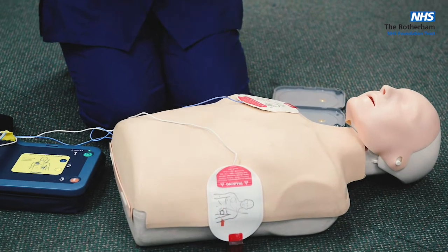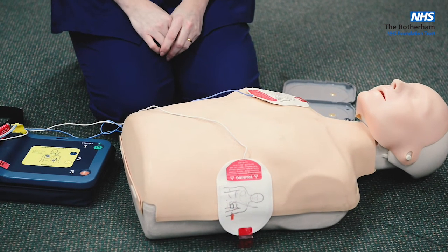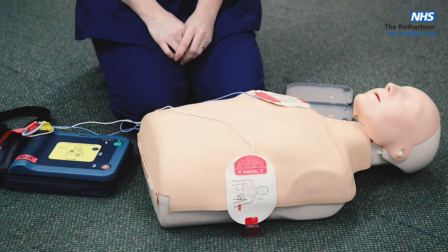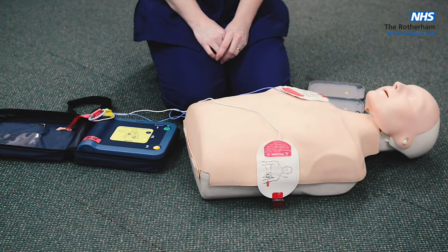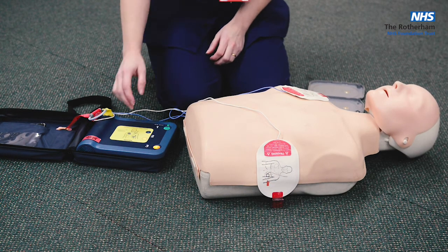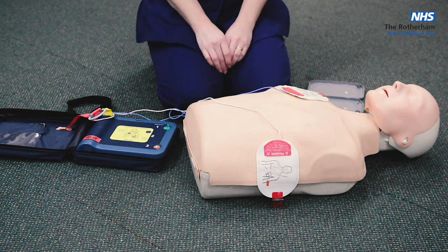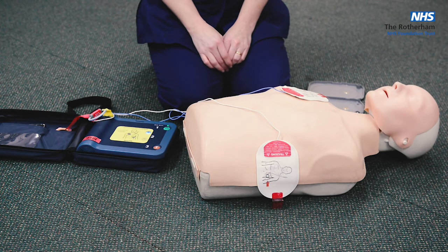The AED instructs you to stay clear of the patient while it analyzes the heart rhythm. Once it advises a shock, stay clear and press the flashing orange button. Make sure everybody is clear before the shock is delivered. After the shock, it confirms the ambulance service should be called and that it is now safe to touch the patient.